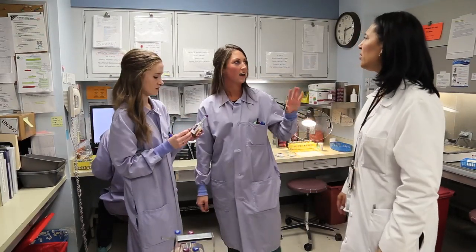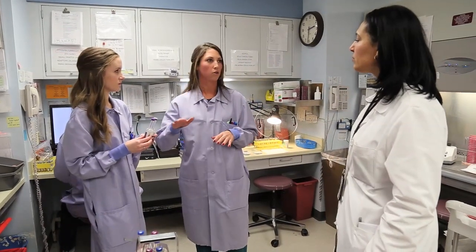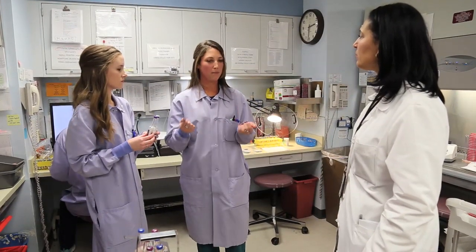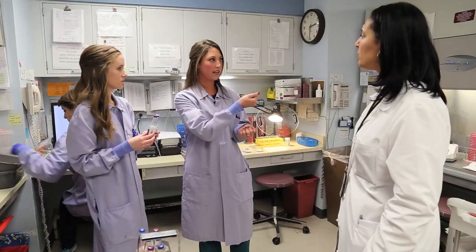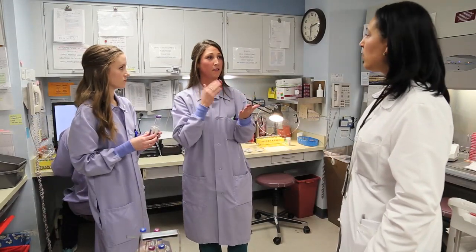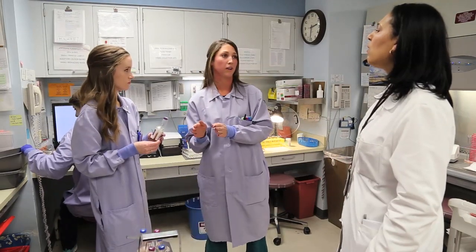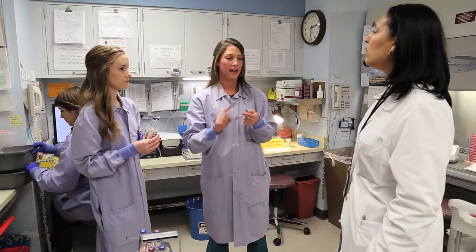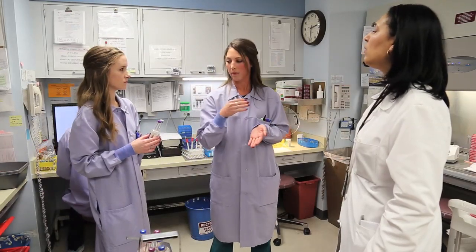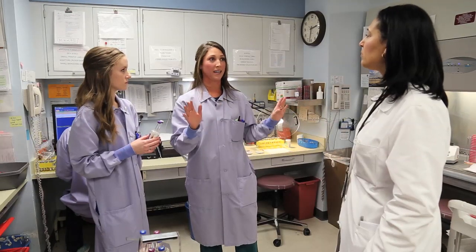So we have labels in the back. We call them dummy labels. They're not associated to any bottle or patient ID. And so when that happens, we have to manually scan it in and then type in the code we want it to say, the time, and then the amount of days that it's supposed to be held. These bottles are pre-programmed, so it knows how long it's supposed to hold that bottle. It has a container ID to go with it. As soon as we put one of those labels on, it's kind of blank. And if we accidentally put something in wrong, that could be an issue.